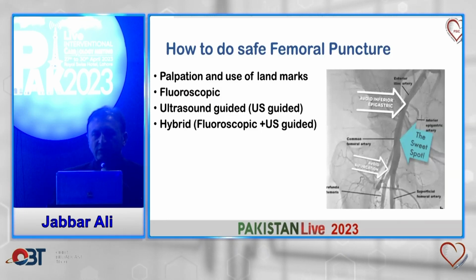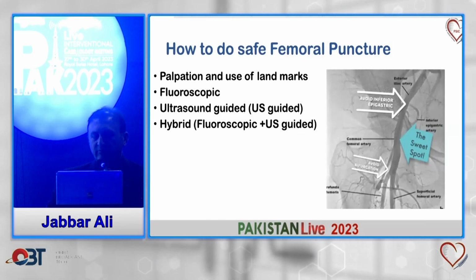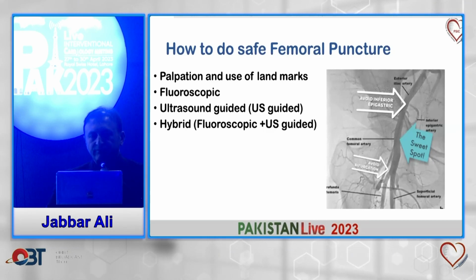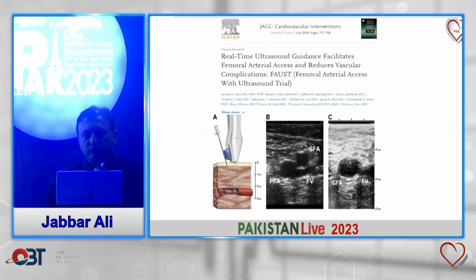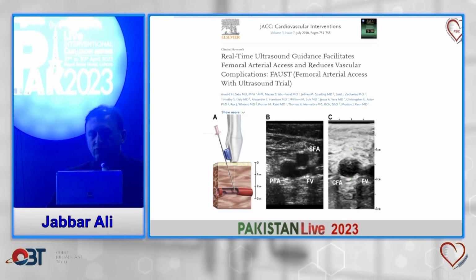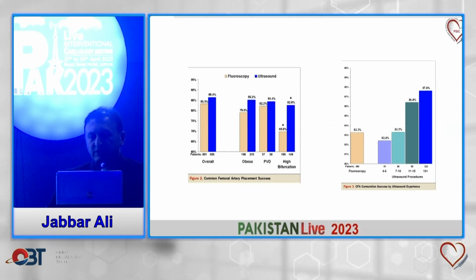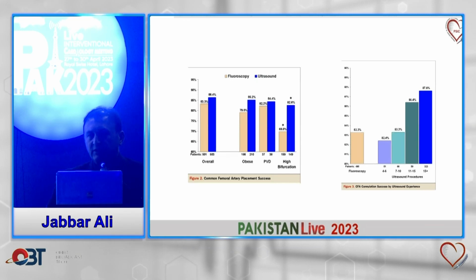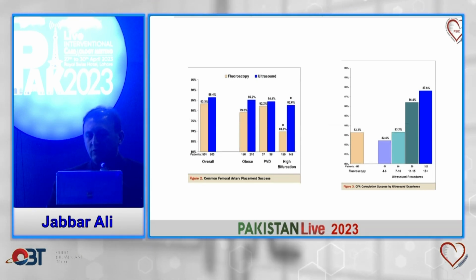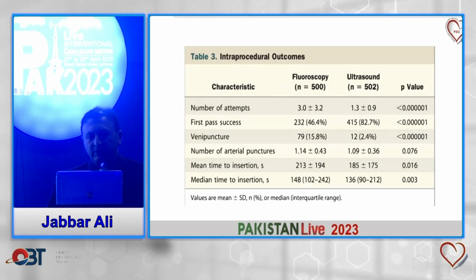We can use palpation, landmarks, fluoroscopy, ultrasound guidance, or a hybrid approach in which we use ultrasound and fluoroscopy. This was the first trial, in which it was shown that ultrasound-guided femoral puncture reduces the time and there is less hematoma. And as you use ultrasound more and more, the success rate will increase. The number of attempts was reduced.